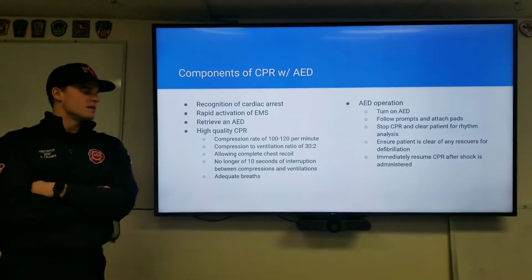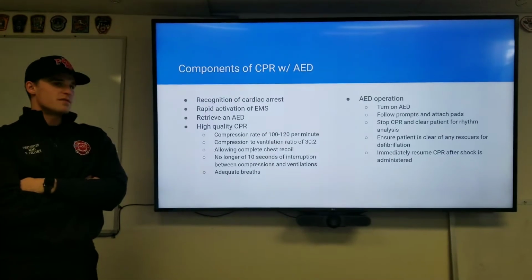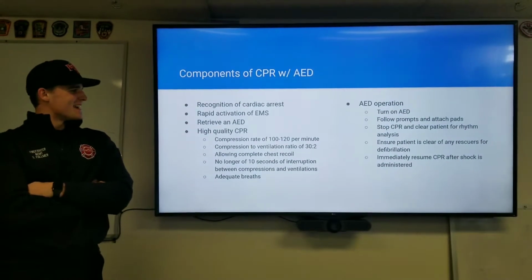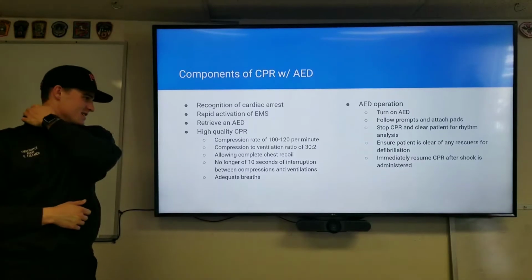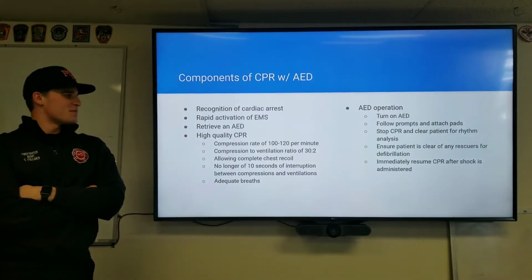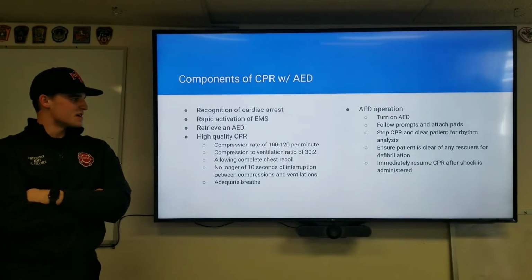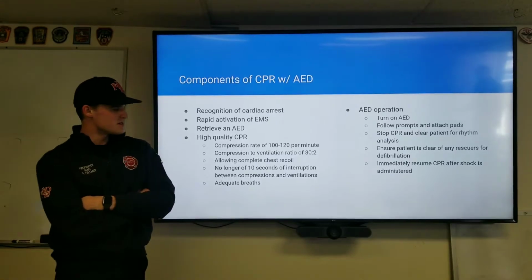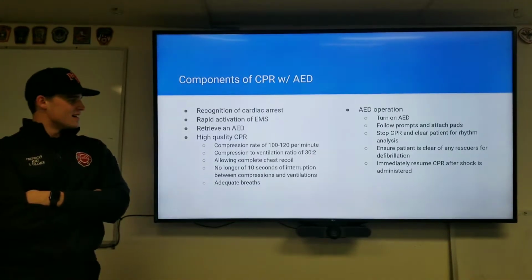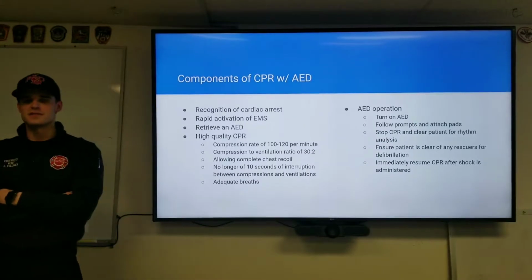And then once you get an AED, if possible, you're going to turn it on, follow the prompts of what it says, and attach pads to the patient. You're going to stop CPR and clear the patient for the rhythm analysis. You're going to ensure the patient is clear when it recognizes a shockable rhythm. And then you're going to immediately resume CPR after the shock is administered.